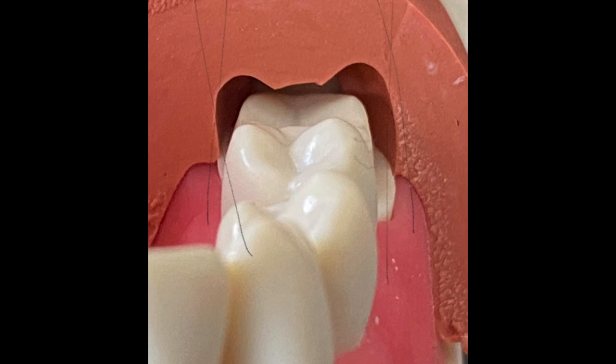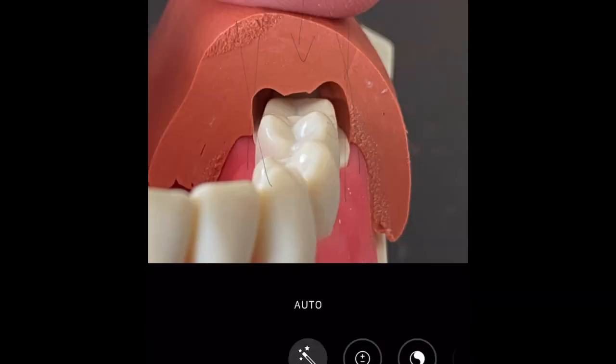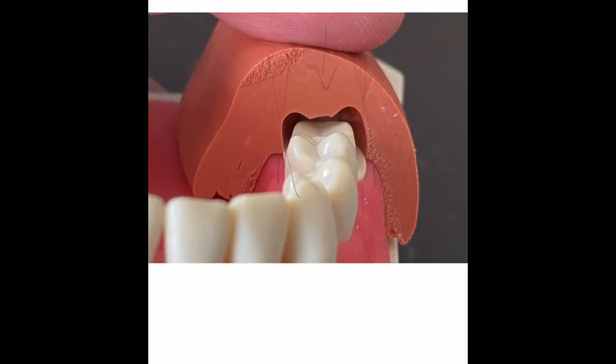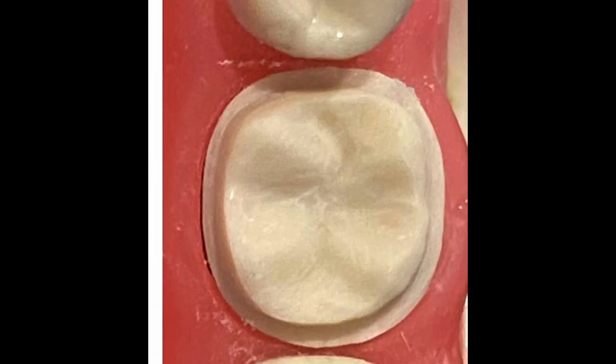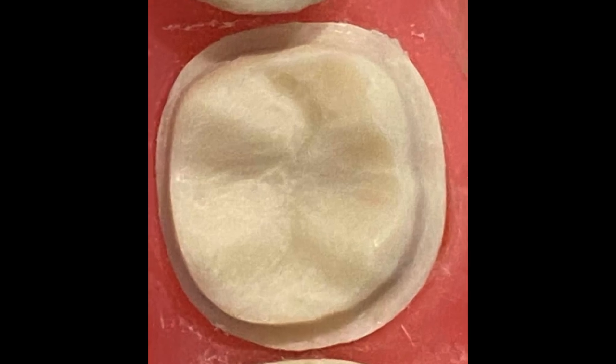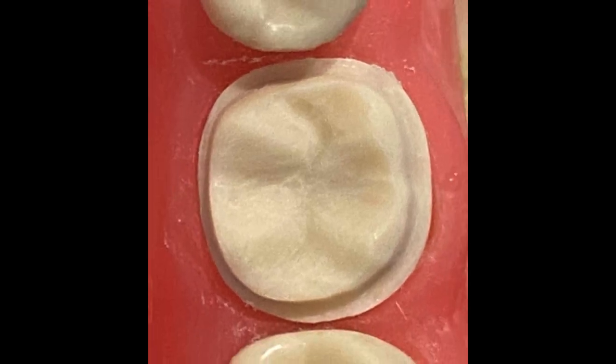Don't confuse yourself too much. You will see in the putty — a lot of people make the same mistake, reducing too much on the palatal just because they are worried that when they look from the occlusal view they cannot see the palatal margin. If you don't see it, that's good — that means you've done a good prep. I'll show you what it should look like. This is my prep. When you see it from the occlusal view, you'll notice the palatal is not very clear.